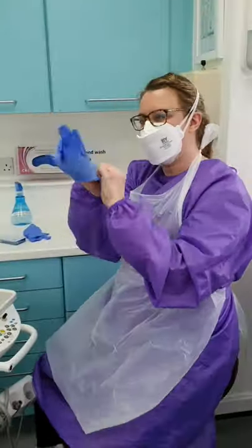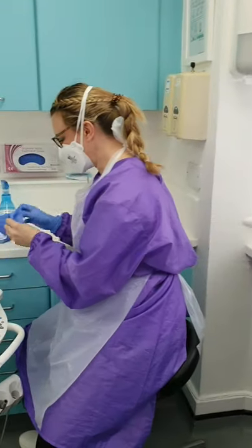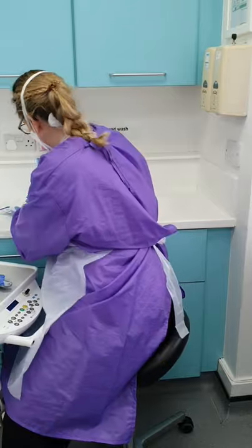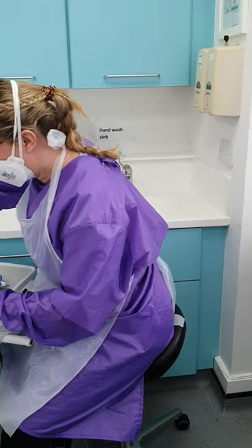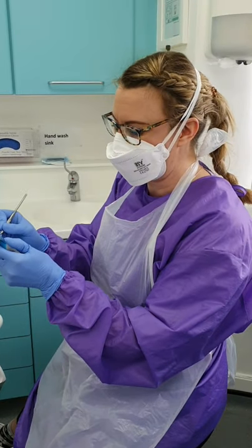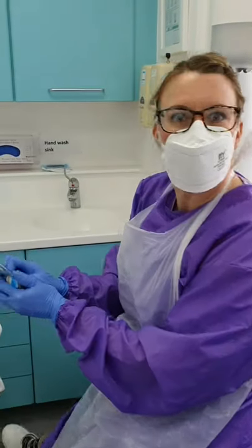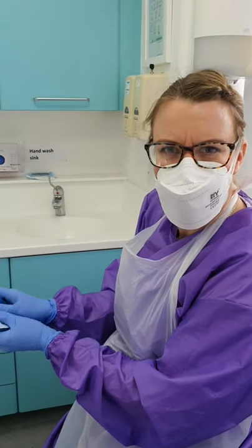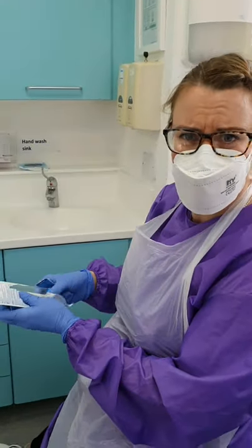So I'm just going to put my gloves on, bear with me. This patient has attended today and she's got a pocket on one of her molar teeth. I'm just going to show you on the video how to get down and really clean it well, because your normal toothbrush won't go into the little crevices.